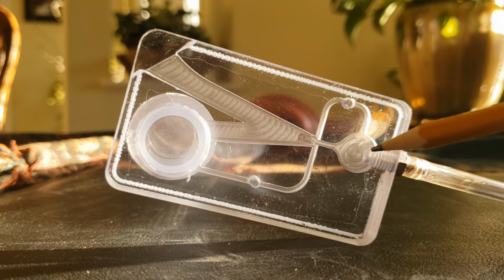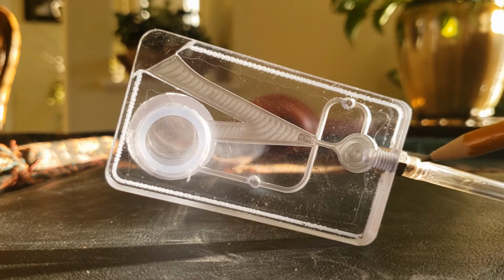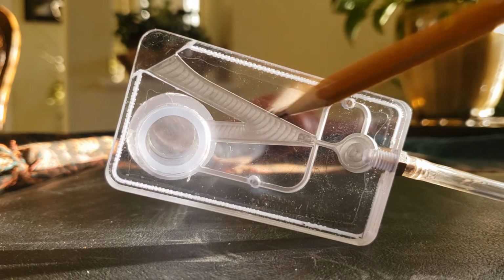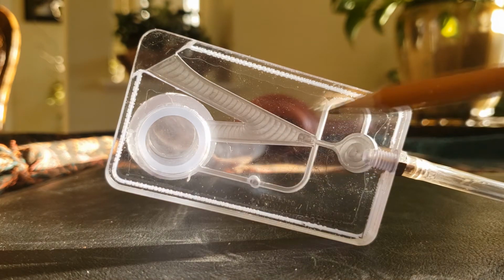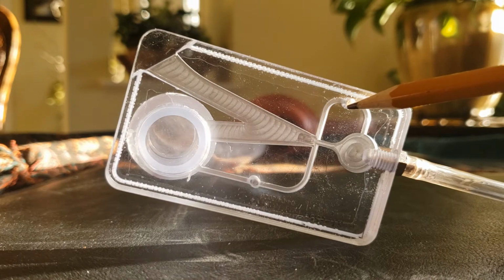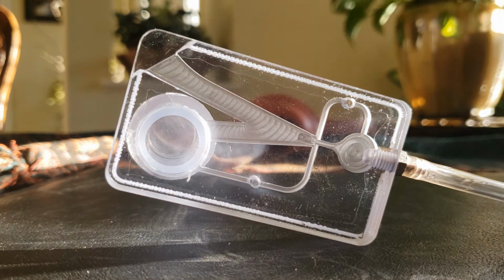This device does one thing, and does one thing only. It takes a high pressure stream of air and switches it from one side to another. It does this at pressures that are determined by these set screws for high and low pressure control. And then we can also partially close the exhale port to set a particular timing for this.